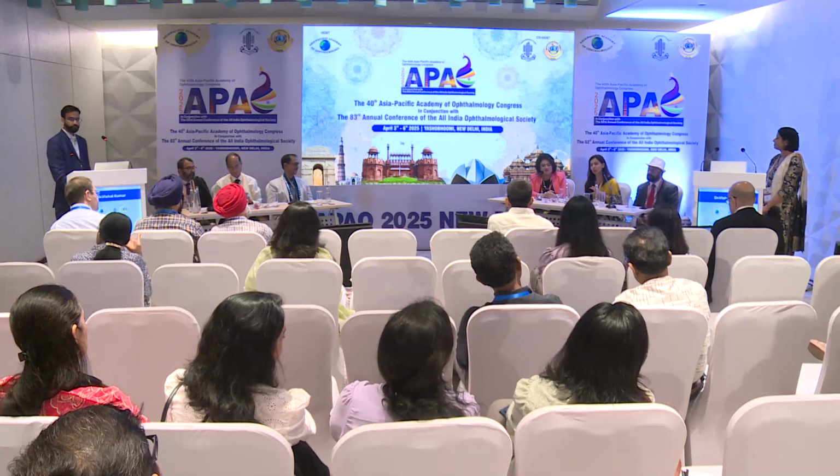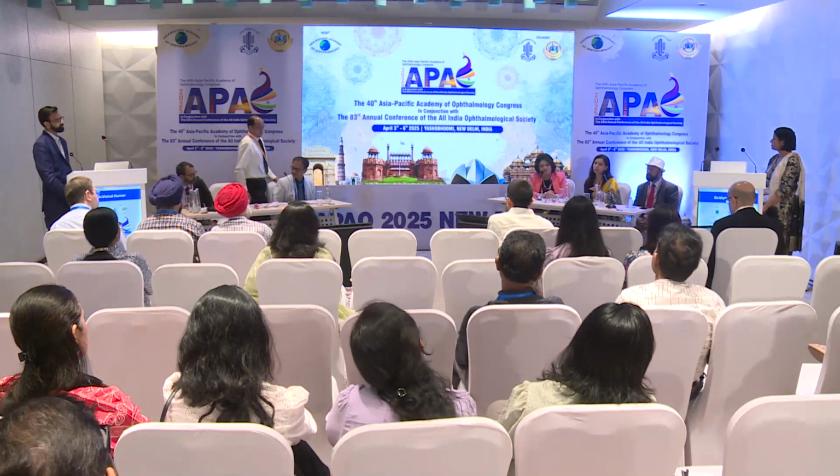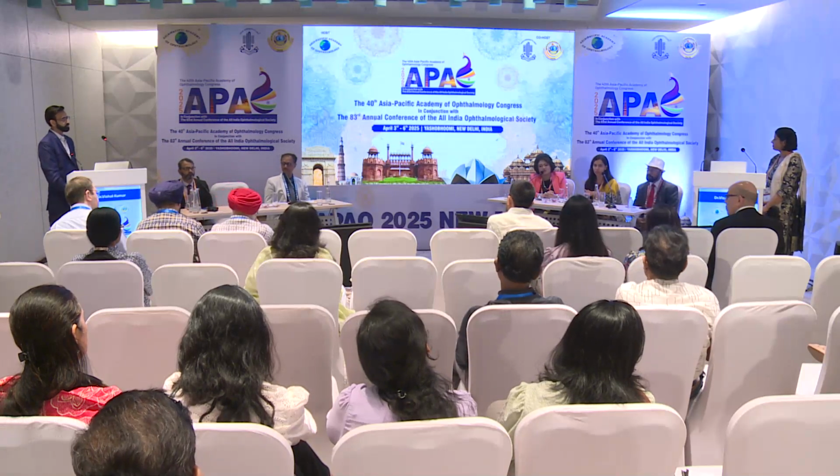So you can ask them how their vision was. And very often, we've all seen these patients who have lived their entire life with a keratoconus or a PMD and never realized it, and come with the cataract. In those, we are not going to be overly aggressive trying to bring them to a 6/6. We are trying to give them what they have lived with and what they are comfortable with.